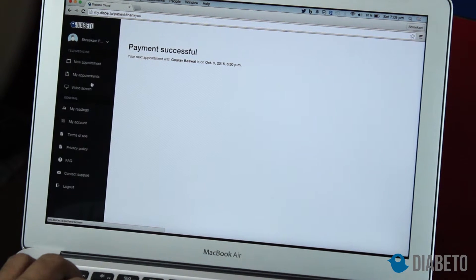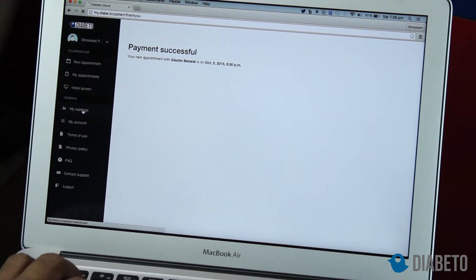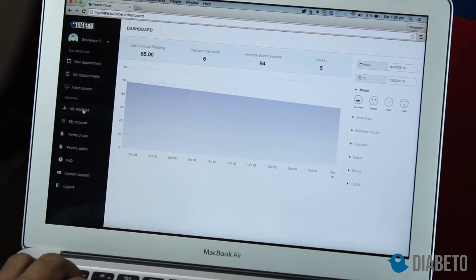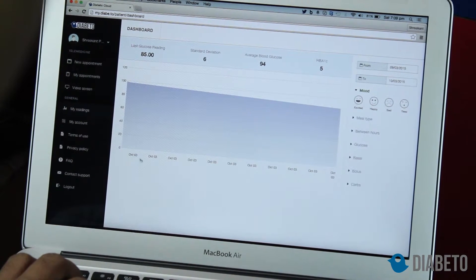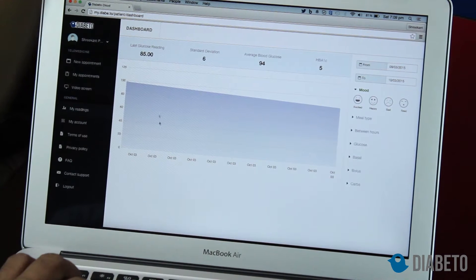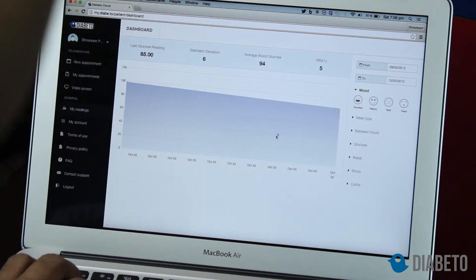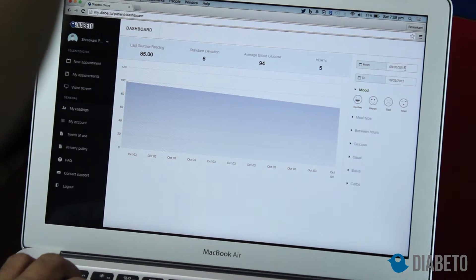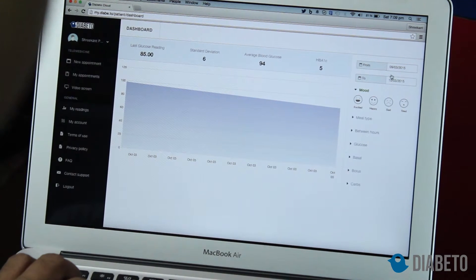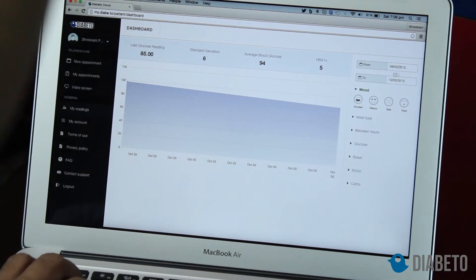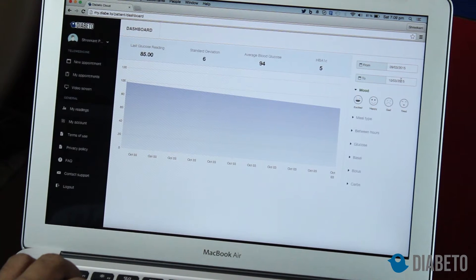That was the telemedicine part. You can also check your readings here. I had taken my first reading of 85 and it has been synced here. On the right-hand side I can select a time frame for the readings — currently selected from the 9th to the 10th, just one day.